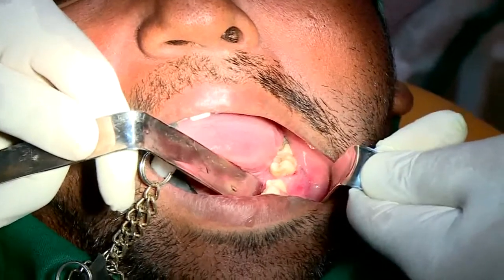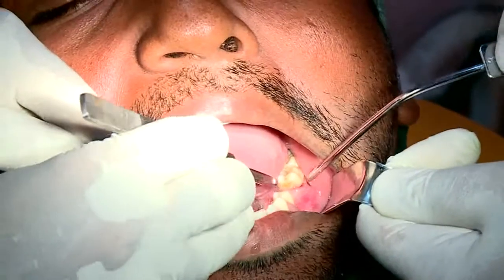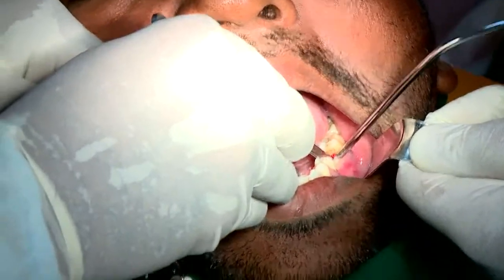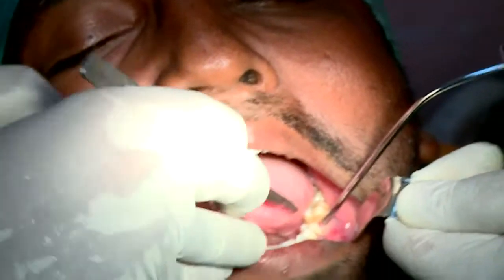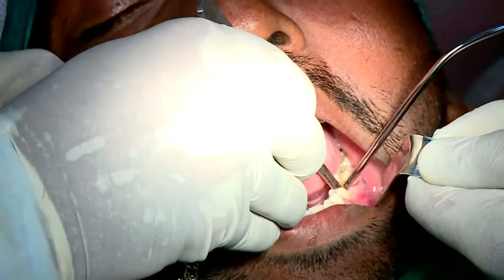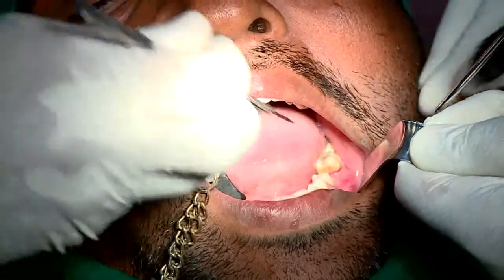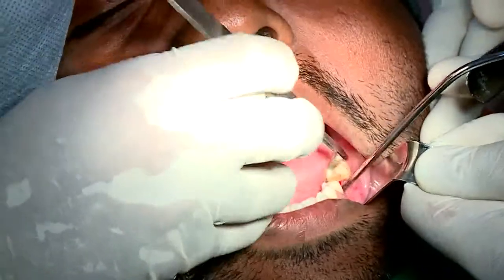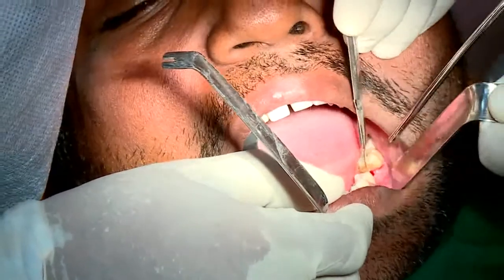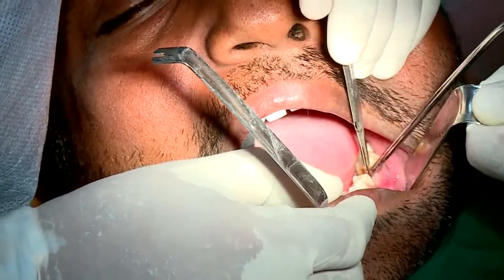Yeah, we can. See, when we are talking about ideal implant placement, there are a lot of concepts here. Particularly when you are coming to the aesthetic zone, people talk about maintaining the marginal gingiva. These are things which are much easier to perform for anybody who is beginning.